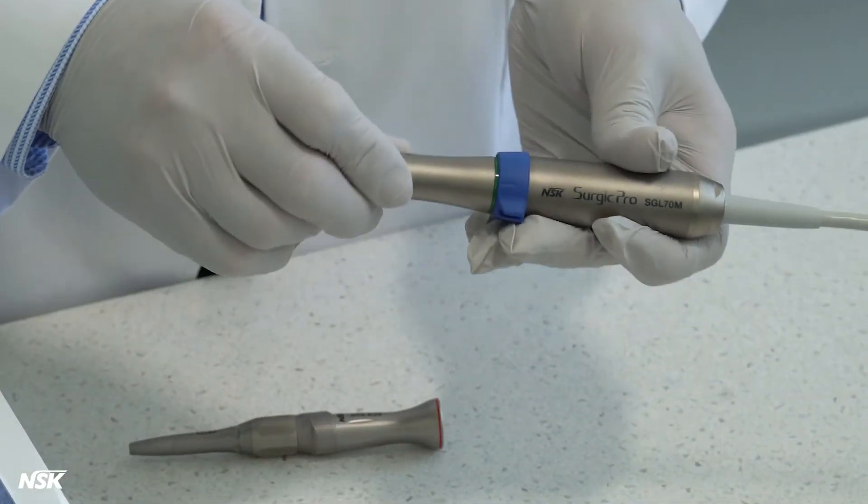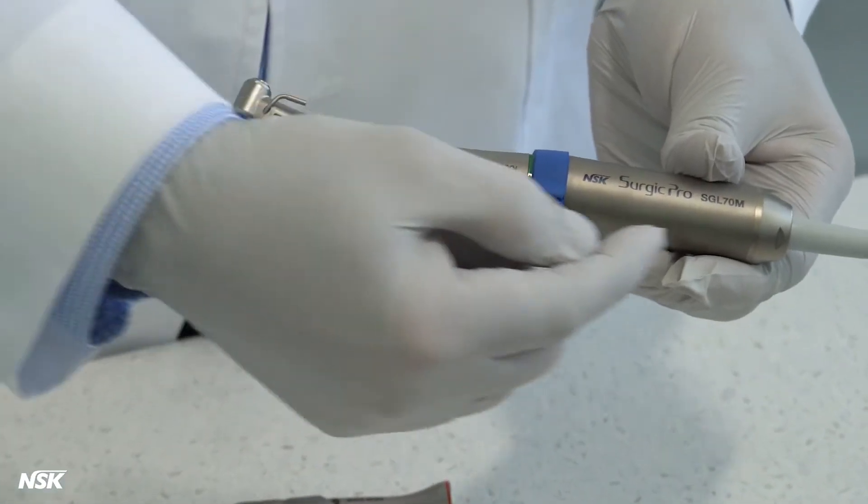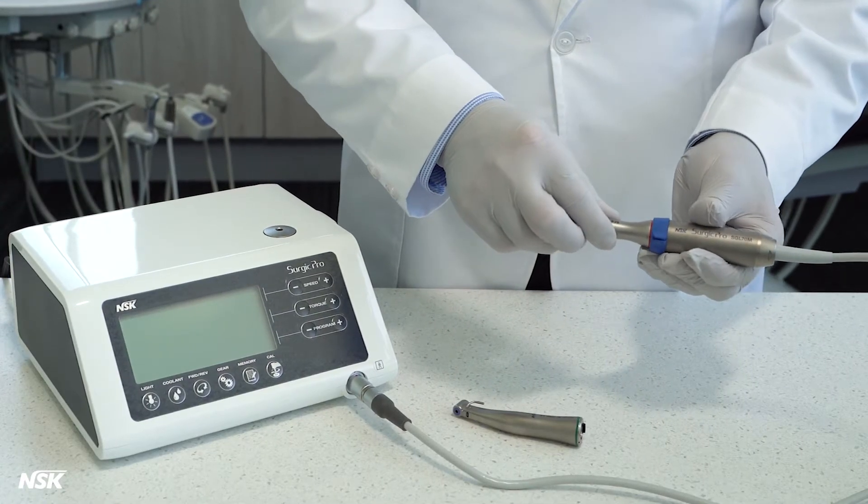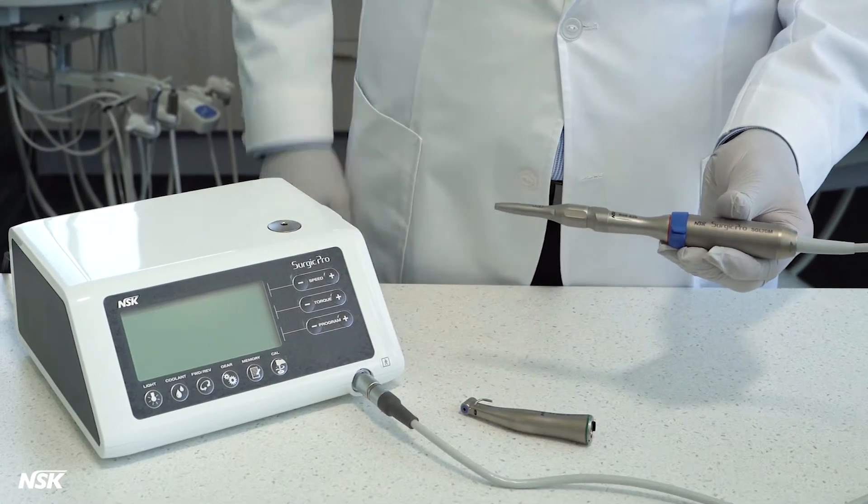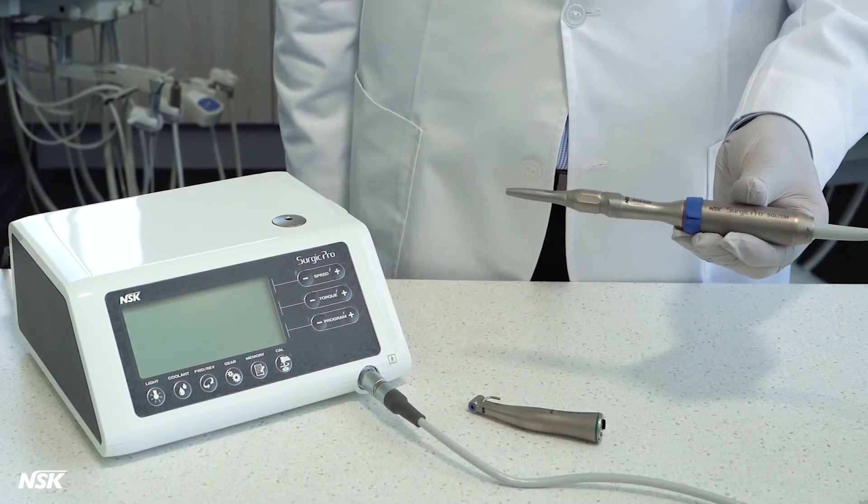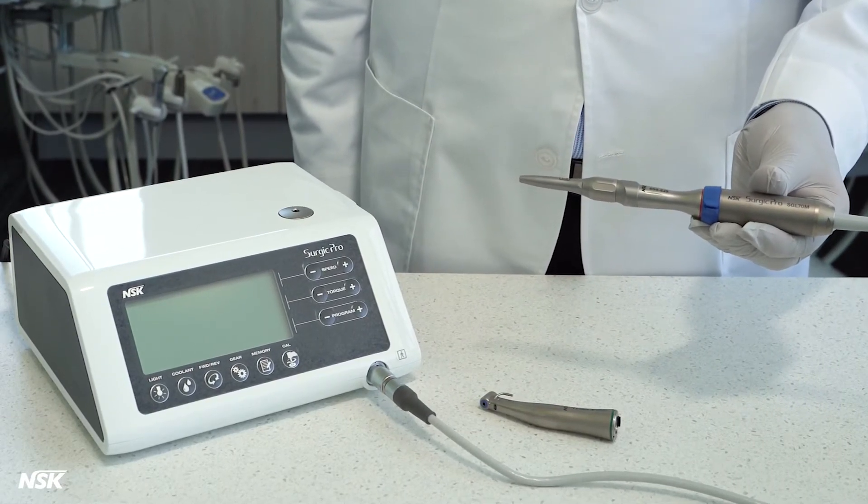Insert the attachment into the motor and twist until it locks in place. Non-optic attachments do not need to be twisted to be locked in. However, microsurgery hand pieces will need to be twisted on non-optic motors to be locked in place.